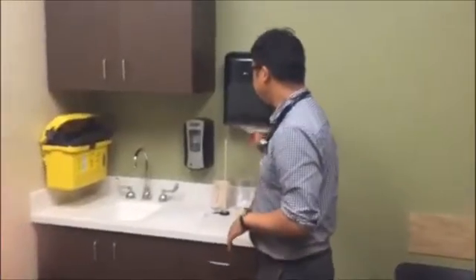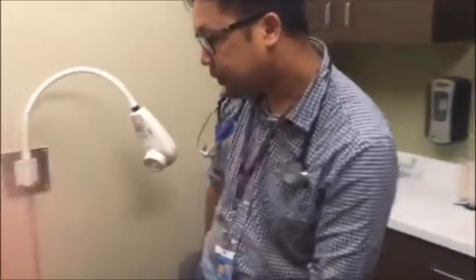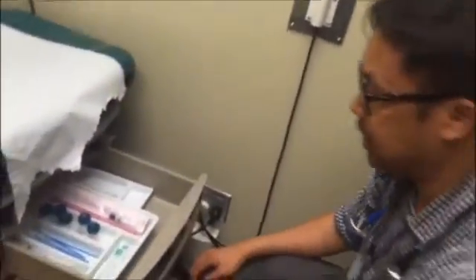Hello everyone, now I'm going to show you how to set up your room for a pap smear. So before the patient comes in and you see on your computer that you have a pap smear coming up, what you want to do is grab a paper towel, set it up on your counter here, and head over to the table. And in the top drawer of the table, what you'll find is the majority of the things that you're going to need for a pap smear.